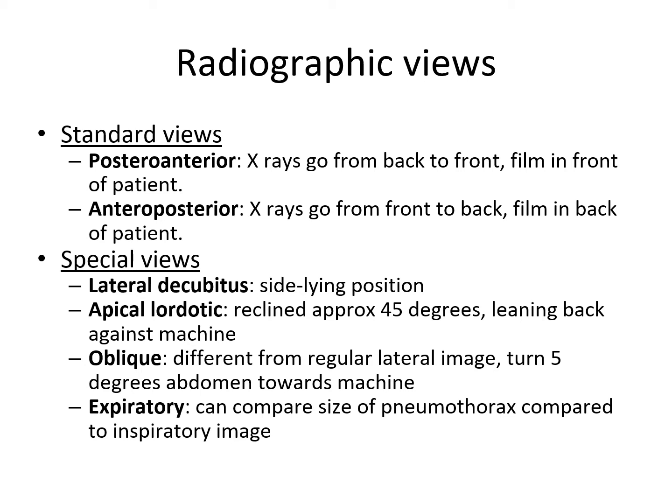Then the x-ray plate goes behind their back, and sometimes we have to help because we're often in the room right after they're intubating. We're checking the ventilator, making sure the tube's stabilized, and sometimes we help bring the patient a little bit forward and get the x-ray plate behind them. They have to lay on it, which of course is uncomfortable because it's just this hard metal plate.